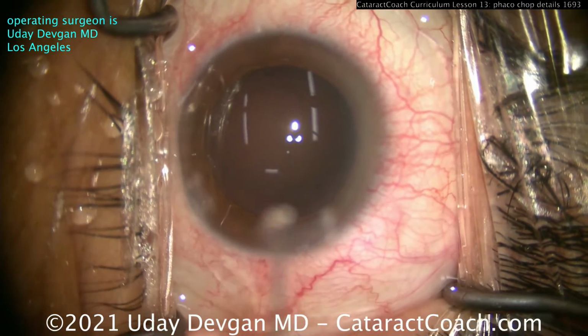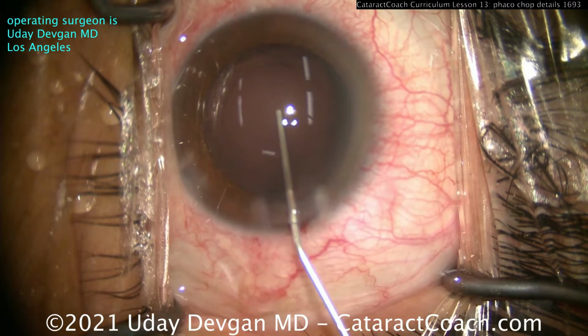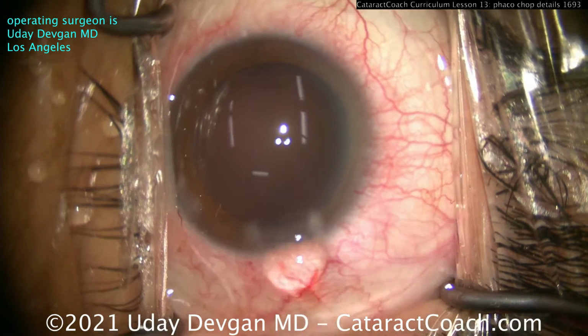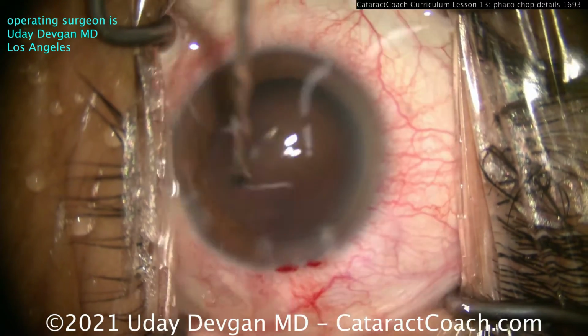So here we go, empty capsular bag. Let's fill it up with our cohesive viscoelastic. Let's put that lens inside and see what we've got. So filling up our bag, good, good, good. Looking very nice. Like that rhexis, here comes the lens.